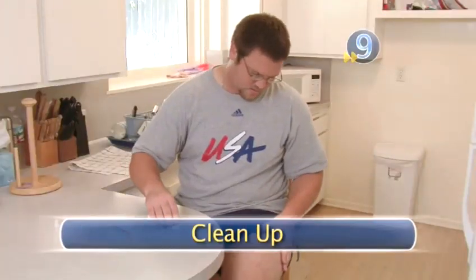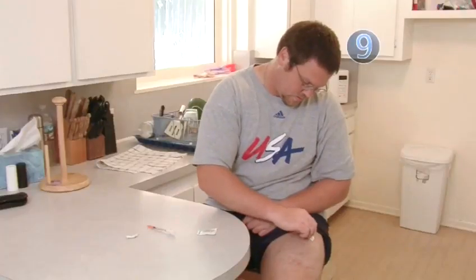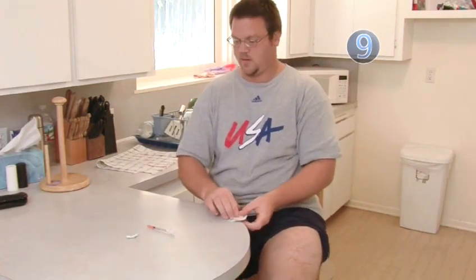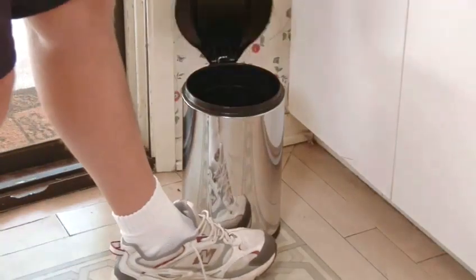Step 9: Clean up. Pull out the needle and rub an alcohol pad over the site. Throw away any used disposable needles and syringes safely in a hard container that the needles cannot stick through. Done.